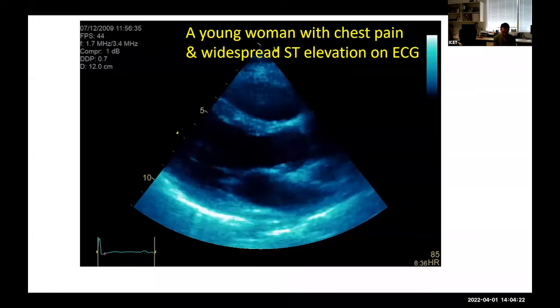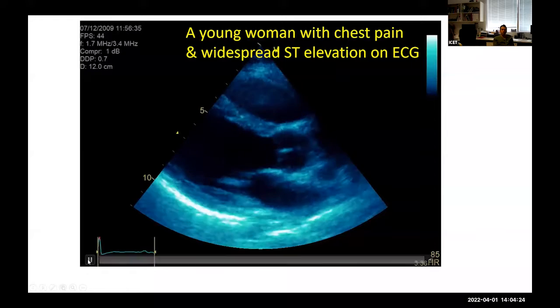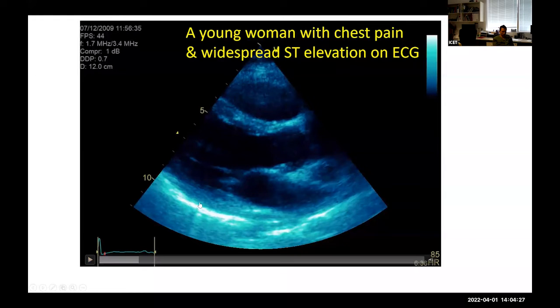Okay, so if I stop, we'll have to measure it. Yeah, we'll have to measure it. But in actual fact, if you take from here to here, then it's a little bit thickened. Yeah, it's more than 2 millimeters.